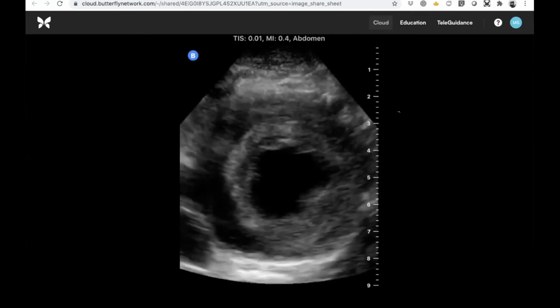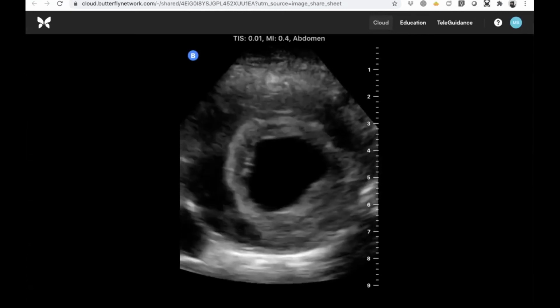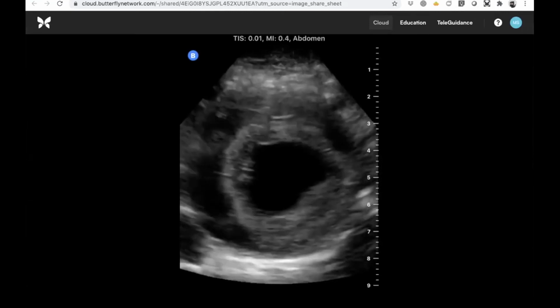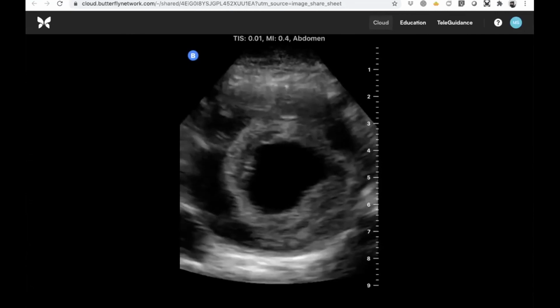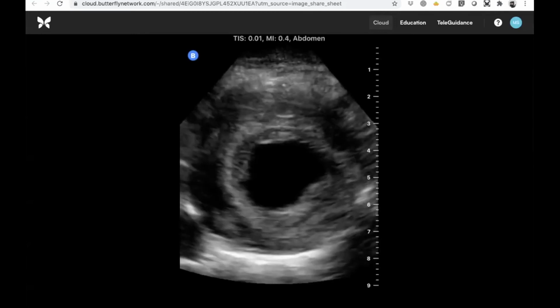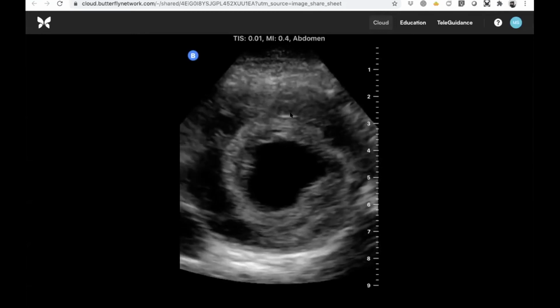And which view would I use for more depth? This view is great, and honestly, you're probably just about 2 or 3 centimeters shy of having enough depth. You're at 9 centimeters here. I'd probably have it at about 11 or 12, and I think you'd see the vertebral body and some shadowing at that point. And you could keep the depth the same for the longitudinal image.